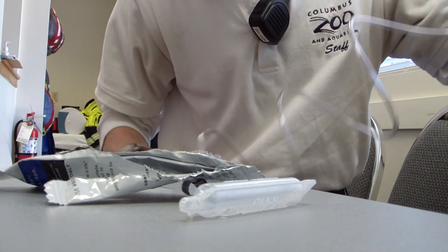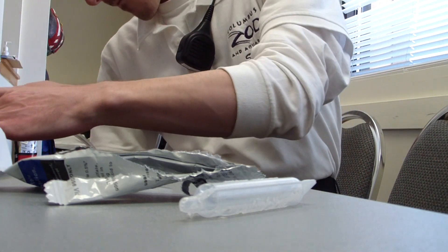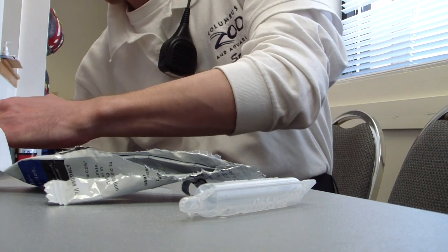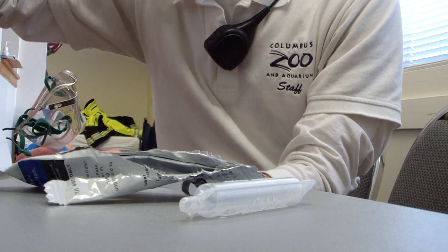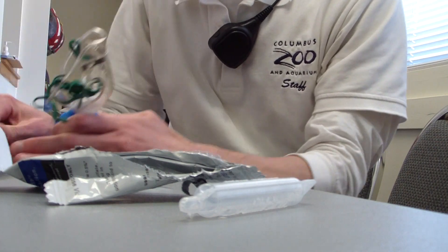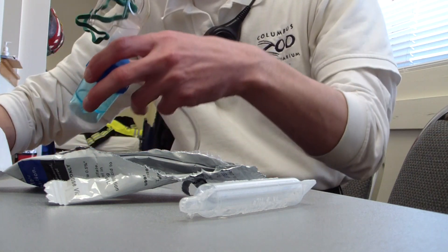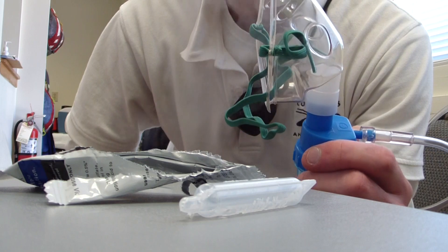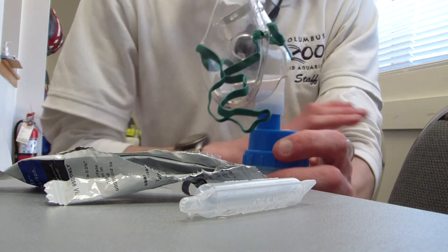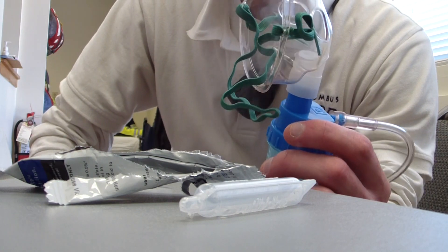Then what we're going to do is plug it into our oxygen line or our oxygen tank. Ours calls for six liters a minute. And you'll see it misting like that — and that's what you want.